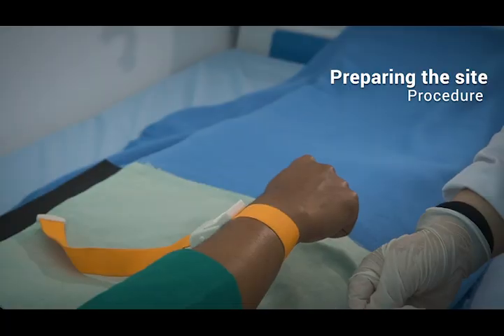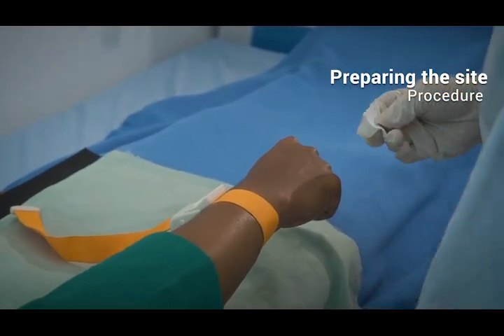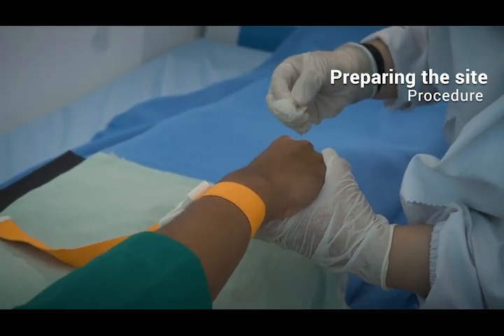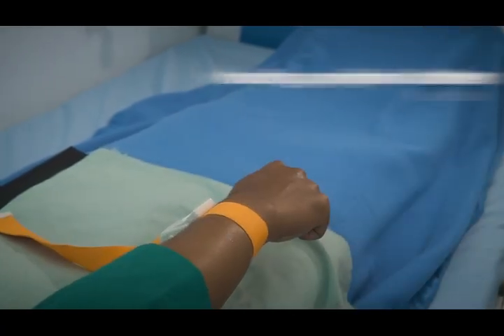Preparing the site. Prepare the insertion site using an antiseptic agent. Apply the agent using a sterile, single-use applicator. Allow the solution to dry completely without fanning, wiping, or blowing on it.